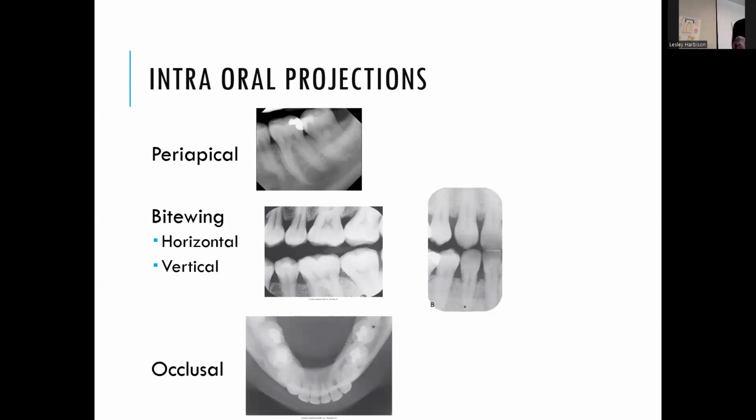That's actually what you want to be taking, vertical bite wings. Usually you're supposed to look back in their chart, know that, and tell your instructors that that's what you're doing. They actually want to know. So this is jumping way ahead to patient care, but it's fun to have those things floating around in your brain, and then when you hear it again, you're like, oh yeah, I heard that one place.